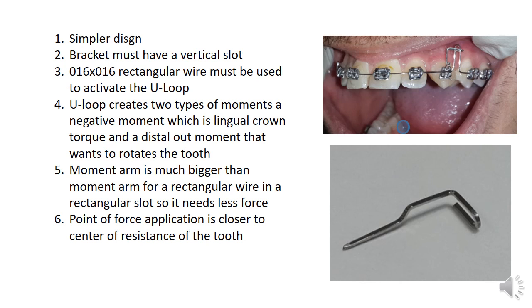That is why it is better to bend the excess of the activation stick here to distal to compensate for this side effect.